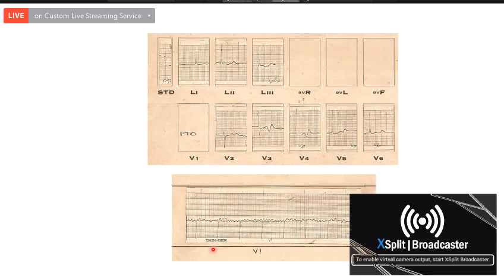New onset atrial fibrillation can be a little more coarse than late onset, because over a period of time the atrial fibrillation becomes fine. But coarse atrial fibrillation is usually associated with valve lesions, especially mitral regurgitation and mitral stenosis. Valve lesions which progressively develop into atrial fibrillation have a very coarse atrial fibrillation. So this patient is having a coarse atrial fibrillation.